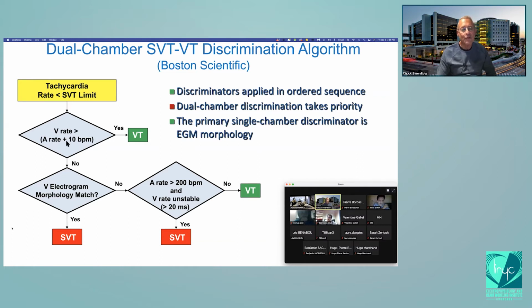The reason for that, and this is a technical point, and it's not something you're going to need to know to solve Dr. Strick's diagnoses, is that they're hedging their bets about exactly how good atrial sensing is. There are various reasons you might not sense an atrial electrogram during tachycardia, including the so-called post-ventricular atrial blanking period.